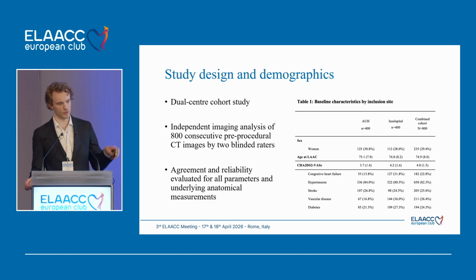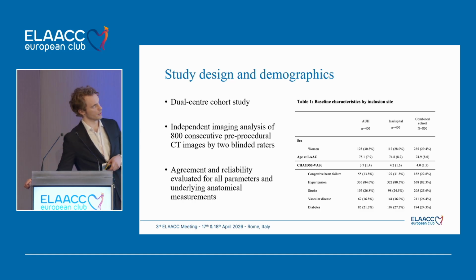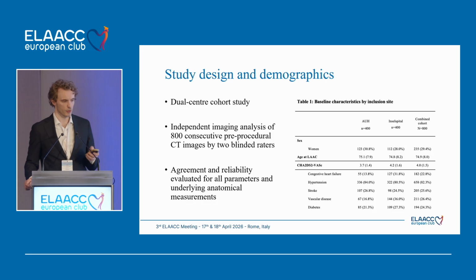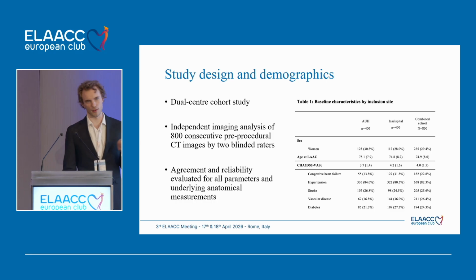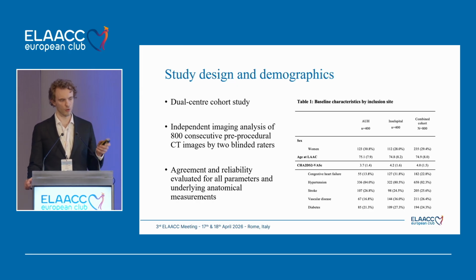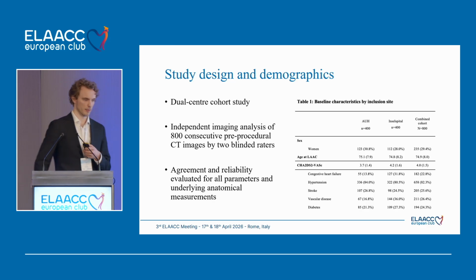prior to procedure averaging around 4, with the Swiss patients having higher rates of congestive heart failure and also vascular disease prior to procedure. Our main endpoints were inter-rater agreement and reliability, which we evaluated for all parameters of the ELAACC score, and also for the combined score, and for all underlying continuous anatomical measurements where applicable.